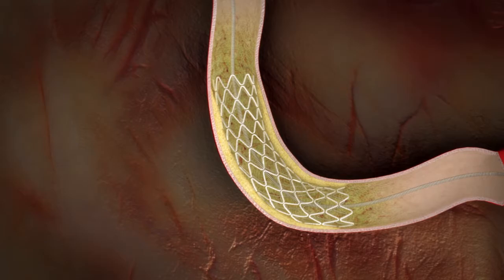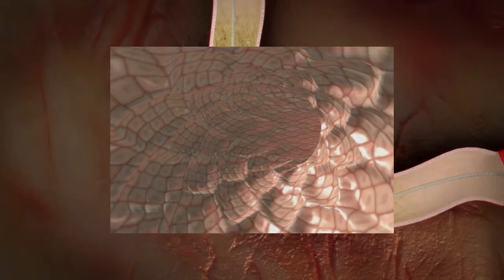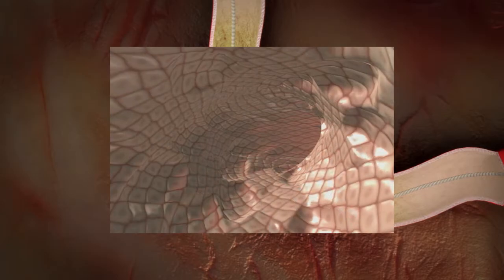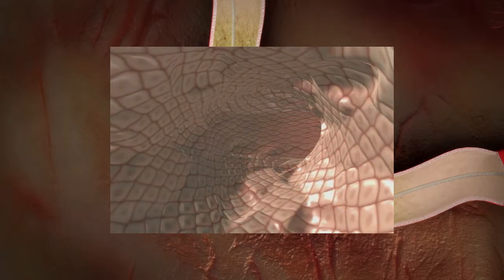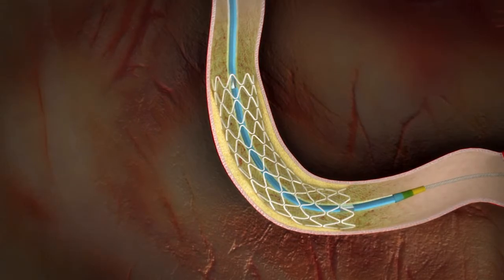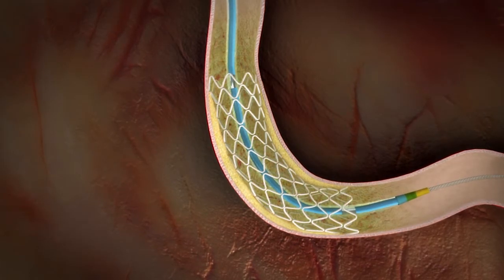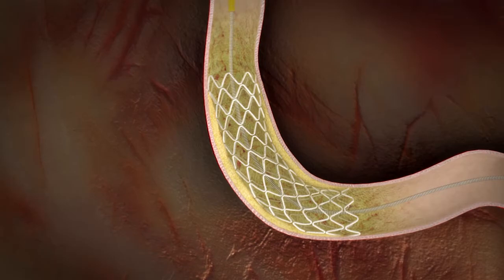You won't feel the stent in your body, and over time, the inside lining of your artery will grow over and cover up the stent completely. To check that your stent is well placed against the artery wall, your doctor may deliver a stiffer balloon through the sheath and into the blockage site. This balloon is inflated to ensure that the stent is fully expanded and pressed against the artery wall.